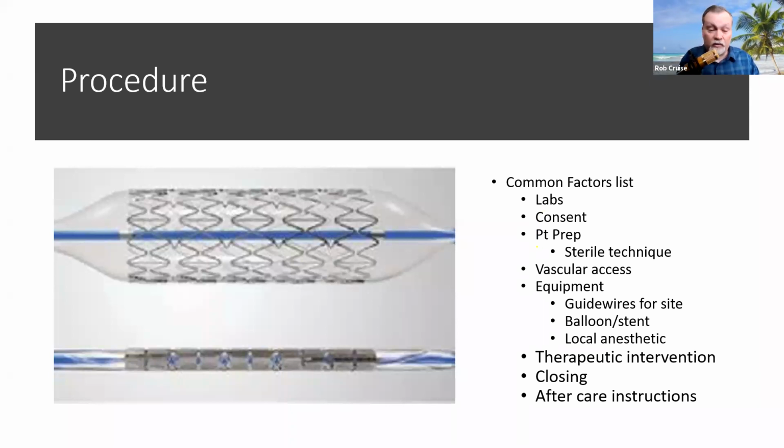Sterile technique, of course, is required for all of these interventional procedures. And you're going to use goggles, because who wants to get body fluids splashed in their eyes? A cap to prevent hair getting onto the patient. A sterile gown and sterile gloves to make sure that anything that is touching the patient is in a sterile fashion. Okay, vascular access we'll need for all of these cases.